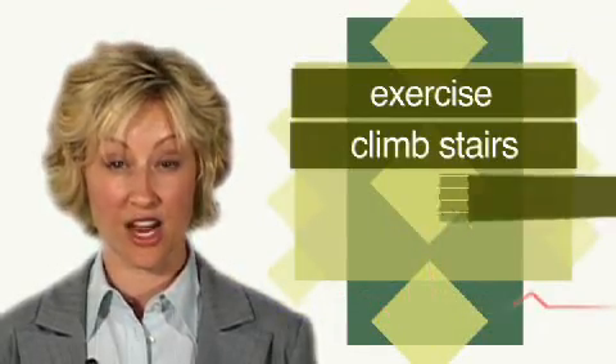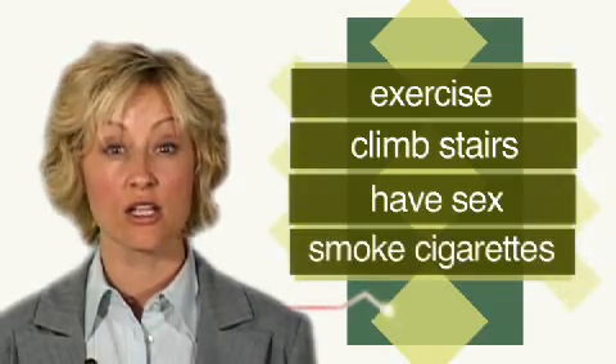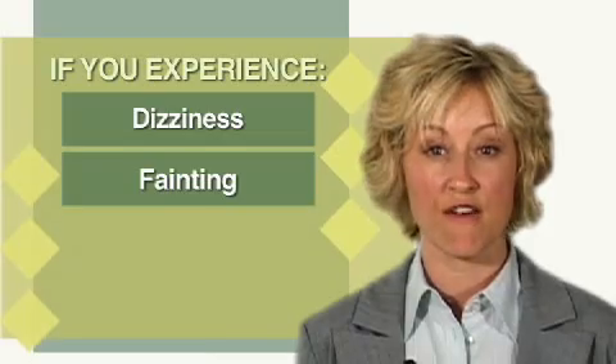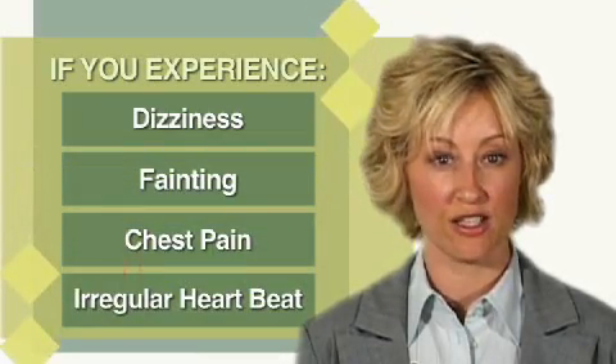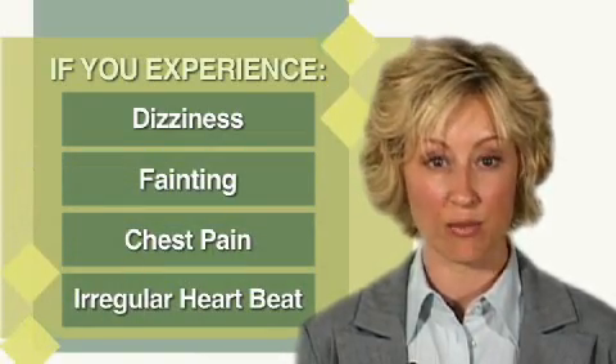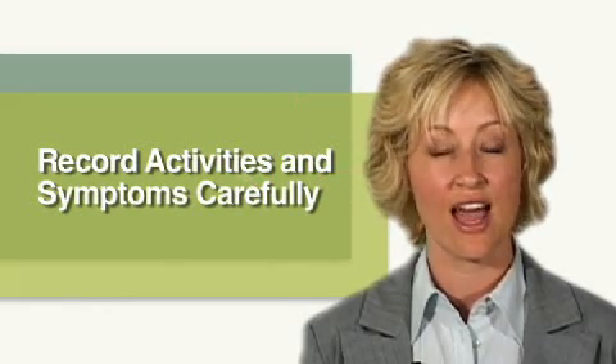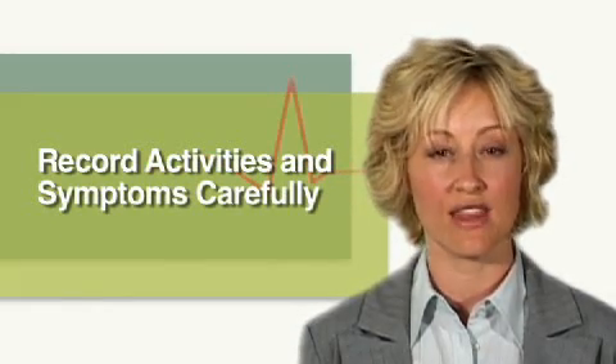For example, when you exercise, climb stairs, have sex, smoke cigarettes, sleep, get emotionally upset, take medications, or perform other activities. If you have any symptoms such as dizziness, fainting, chest pains, or irregular heartbeat, write down the exact time and duration of the symptom. The accuracy and usefulness of this test depend on how carefully you record your activities and symptoms and the times they occur.